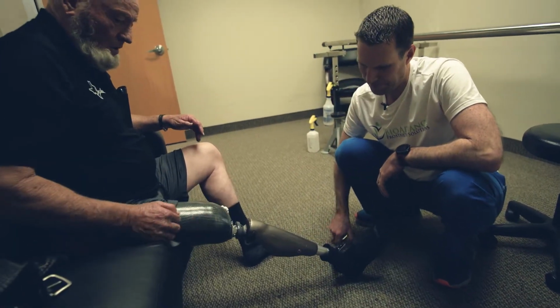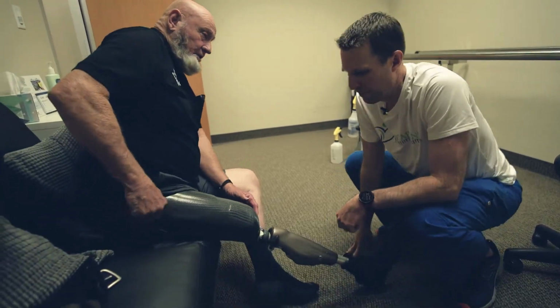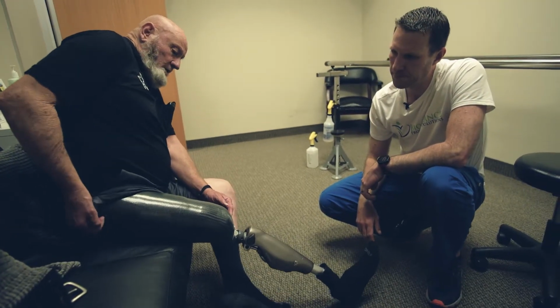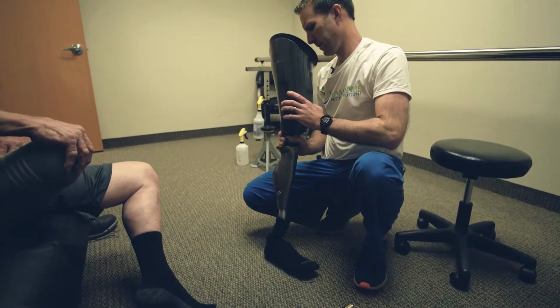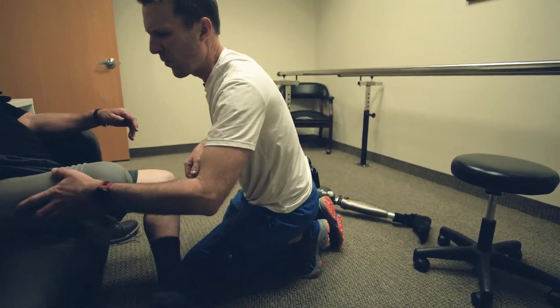Hey, before I walk, I want to take this off and let you look at this liner because I just changed liners in this thing, and because the one I had was worn out, I threw that away. But I want to make sure this one checks out, the fit and everything. Oh yeah, no, that's perfect.